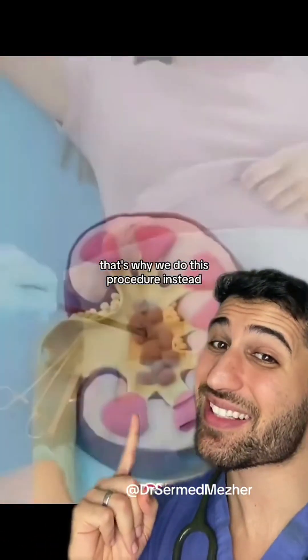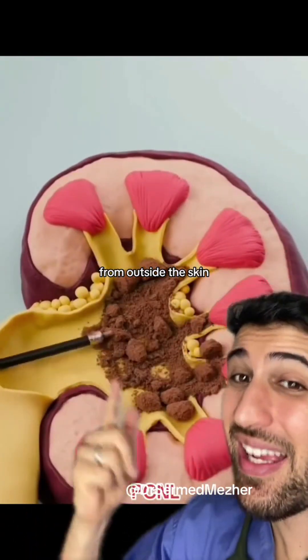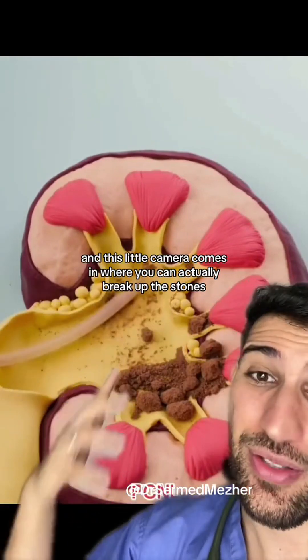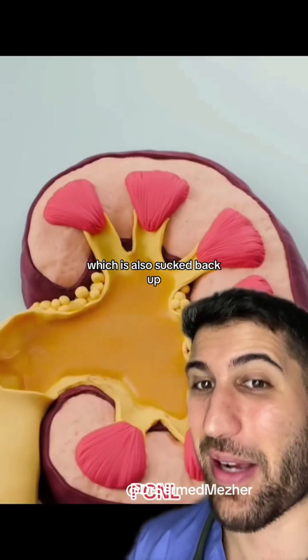That's why we do this procedure instead, called a percutaneous nephrolithotomy. A small cut is made inside the kidney from outside the skin, and this little camera comes in where you can actually break up the stones, hoover them up, and then wash them out using a solution of irrigation which is also sucked back up.